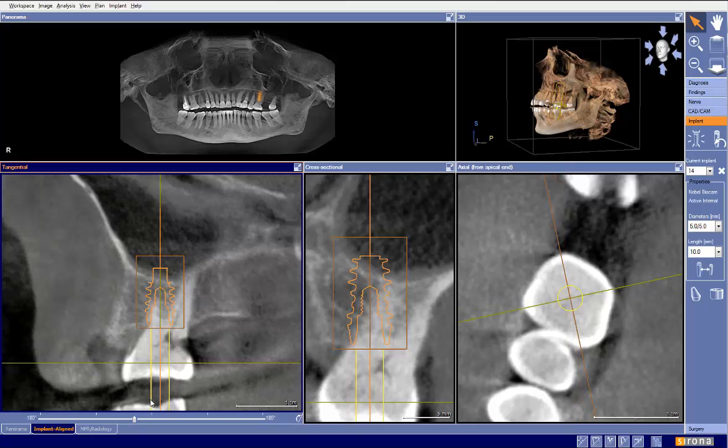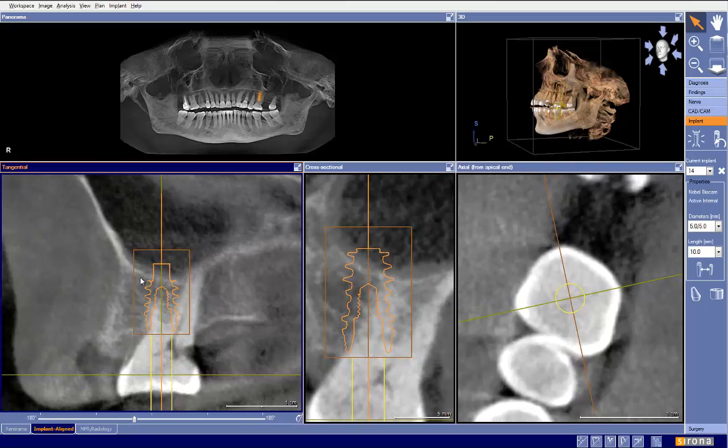That's probably a better look at it right there. So we can see fresh bone for these threads, some fresh bone here for these threads. Go ahead and do my osteotomy right to the base of the sinus. Go ahead and gently lift the sinus floor, place a collagen plug, place some bone, push the implant in through the bone, and the implant will push the bone up, and we should be pretty straightforward there.